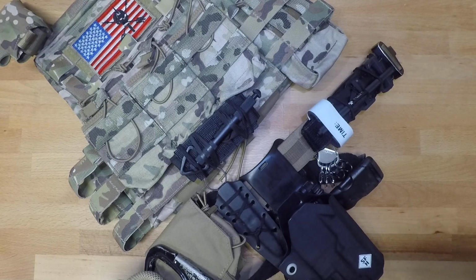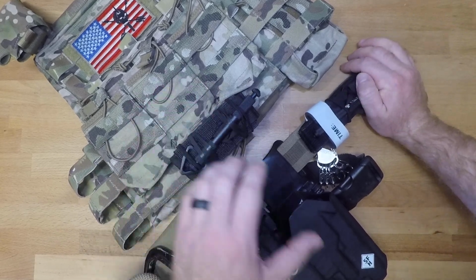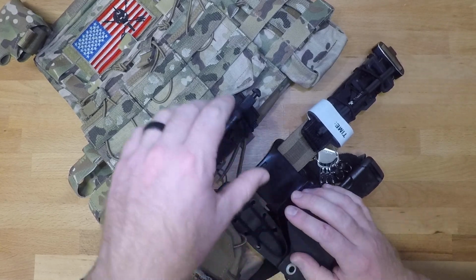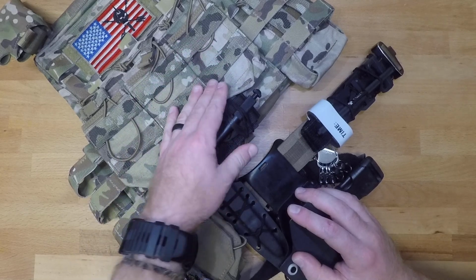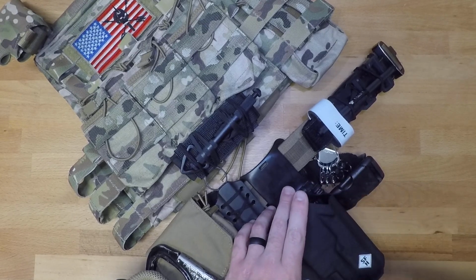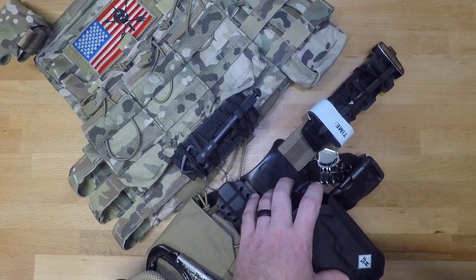So when it comes to tourniquet placement, I highly recommend setting up your tourniquets on the center of the belt, or just to the left or the right of the center of the belt, depending on how that belt is set up, and then centrally locating the second tourniquet on the bottom of the plate carrier, so that way they are both very easily accessible by the individual that may be injured, so he can provide self-aid to himself. Even if he's lost use of one of his arms, he can still apply it to himself.